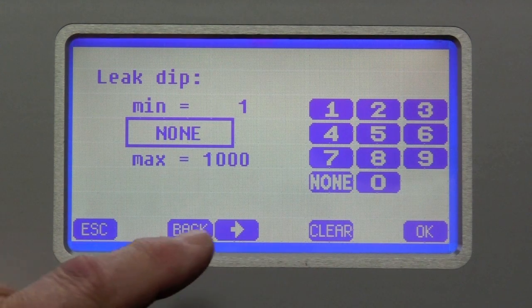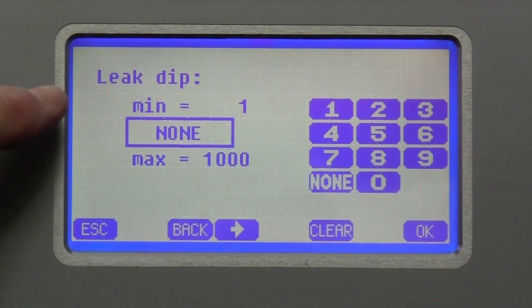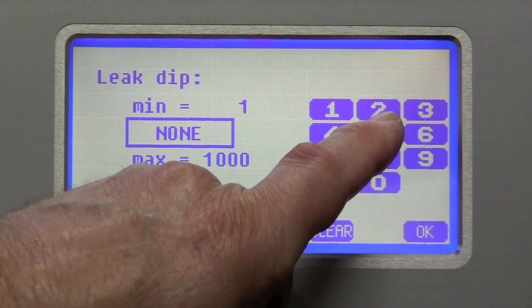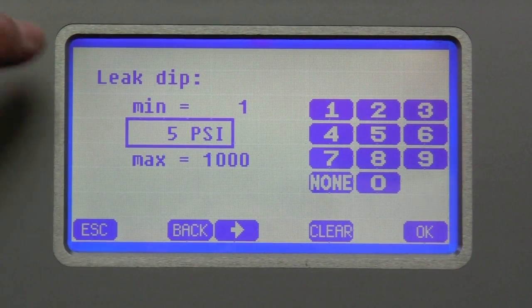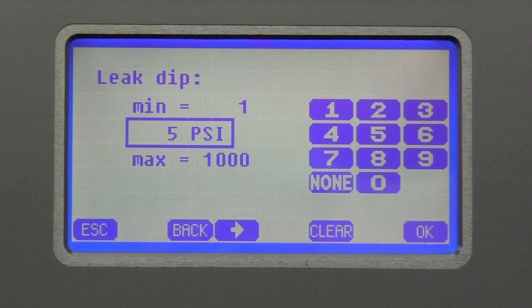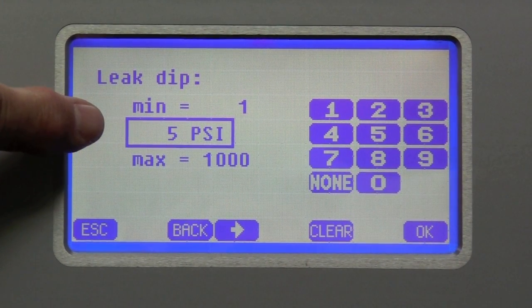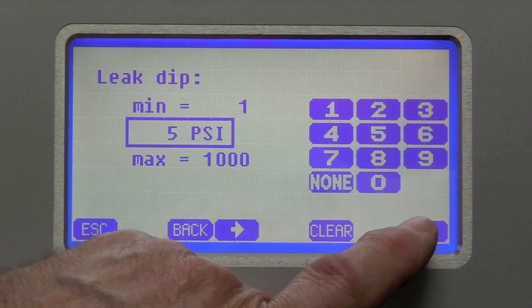However, if the leak is smaller than that, we use a different term called leak dip. And we're going to use 5 PSI leak dip. So that means that if at any time during the leak detection period, it drops more than 5 PSI, it will declare a leak.